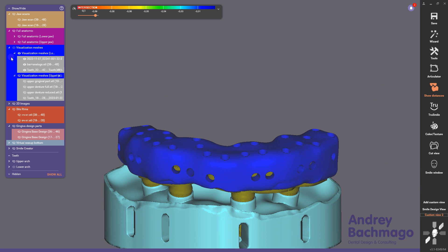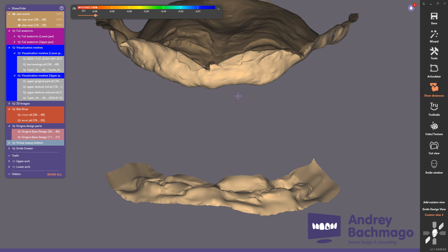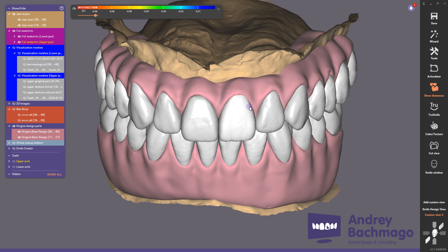The next step is fitting the prototype on the upper jaw and getting the new position for the lower scan bodies on the model. We will make a new temporary bridge on the lower jaw with direct connection to the MUA, with ultra-screws. On the upper jaw we plan to create surgical guides and do immediate loading.